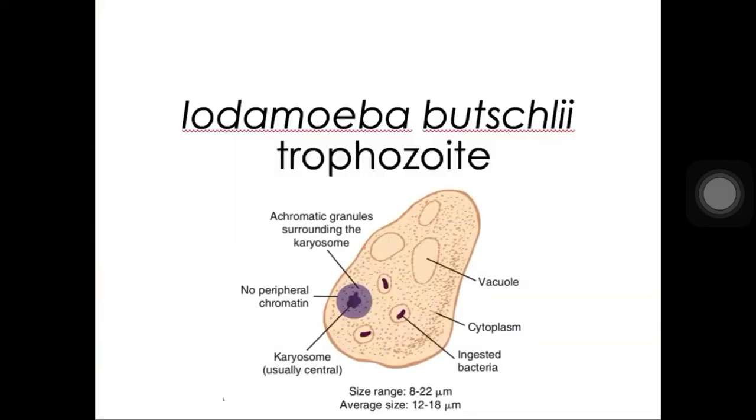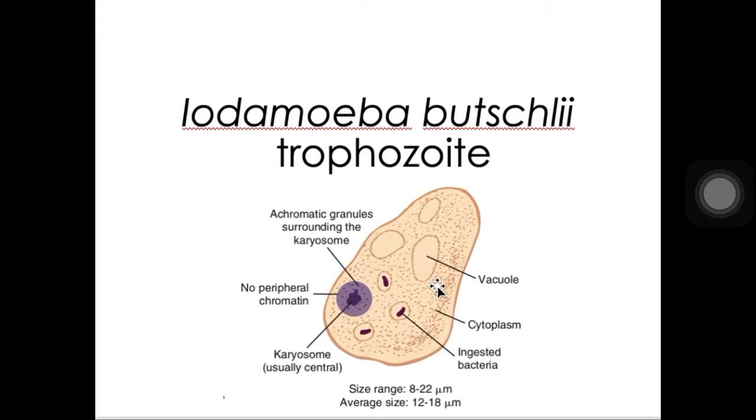Okay, so this one is Iodamoeba buetschlii trophozoite. Okay, medyo mahirap po siyang ma-identify, yung trophozoite niya. But nevertheless, siguro if they will ask Iodamoeba buetschlii, they will show yung cyst form kasi mas unique yung kanyang cyst because of the presence of a large glycogen mass.